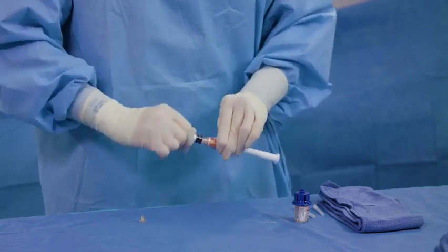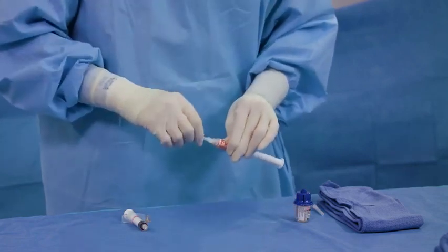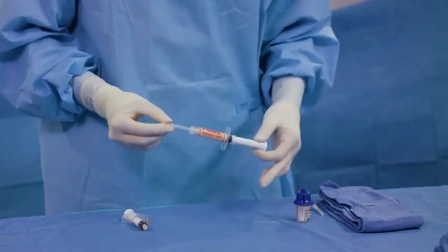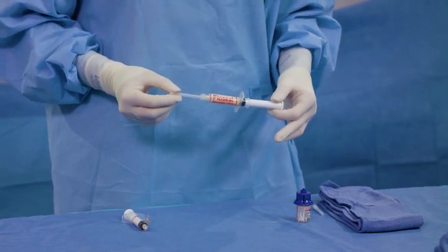Flow Seal matrix may be extruded directly from the syringe. If desired, connect an applicator tip to the Flow Seal matrix syringe. Allow 30 seconds after preparation before Flow Seal matrix is applied to ensure optimal product consistency. Flow Seal matrix may be used up to 8 hours after mixing with the thrombin solution.